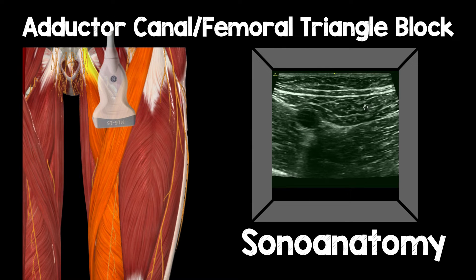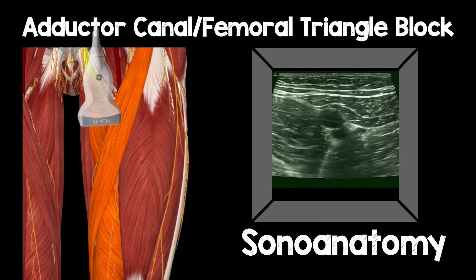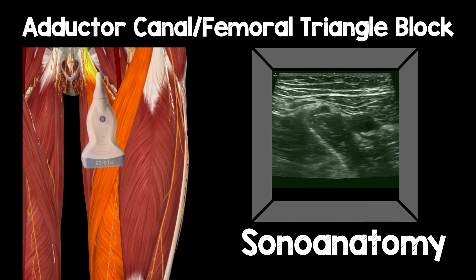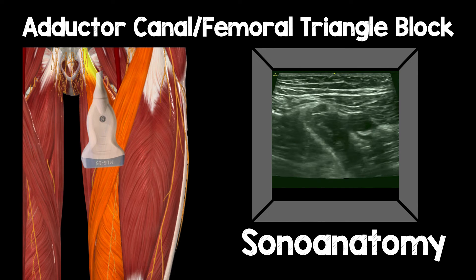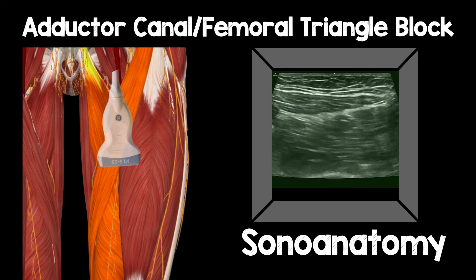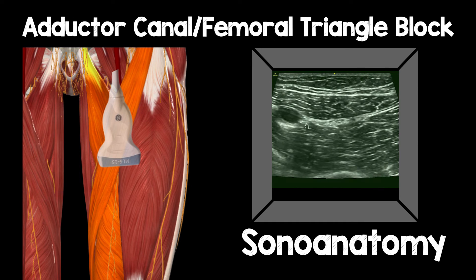Let's imagine we place a probe on the middle of the thigh — here you can see the probe placed quite high up, and this is the corresponding ultrasound image. We can see vastus medialis, adductor longus, and sartorius with the superficial femoral artery in the centre. Sliding the probe medially and adjusting, we get to the point where the medial border of adductor longus meets the medial border of sartorius — that's the apex. Then slide the probe laterally to see sartorius, vastus medialis, and the femur deep to it. The nerve to vastus medialis lies in that plane between sartorius and vastus medialis, and the saphenous nerve lies right next to the artery.